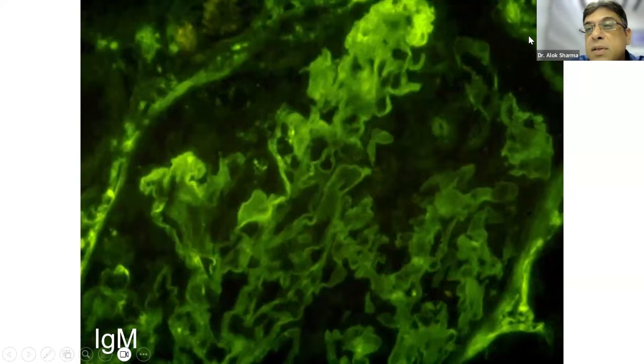Although there are no immune complexes here, IgM is a very large molecule, so it has a tendency to get stuck or entrapped in areas of sclerosis. When you do an IF examination, you can actually pick up segmental sclerosis even on an IF section, although you're not seeing the morphology there. This is an IgM slide. So you had an FSGS lesion on light microscopy, and negative IF.